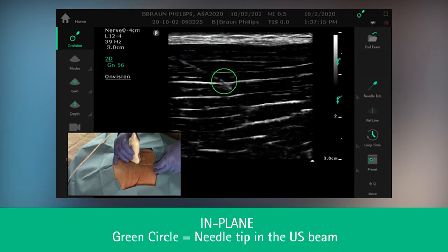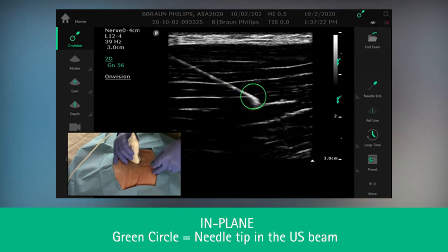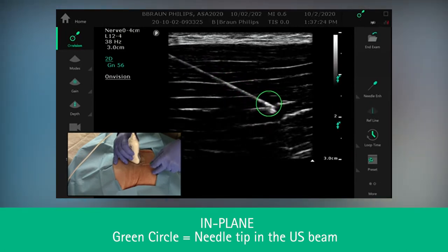At this point, bring back into focus the needle shaft. You can see as we advance in real time, we maintain the tracking of the needle tip.